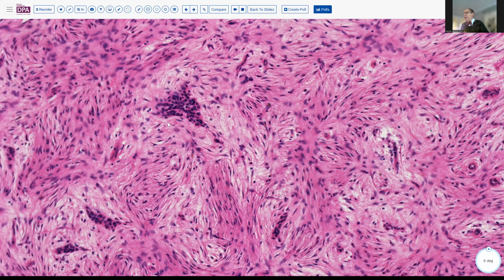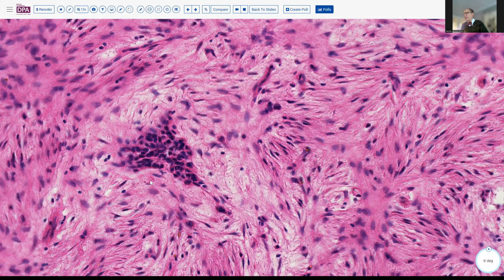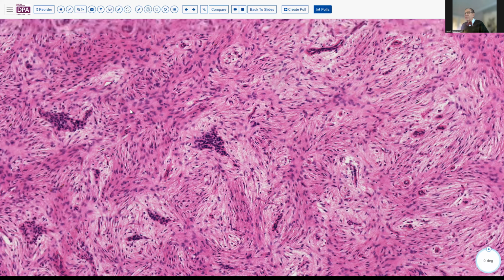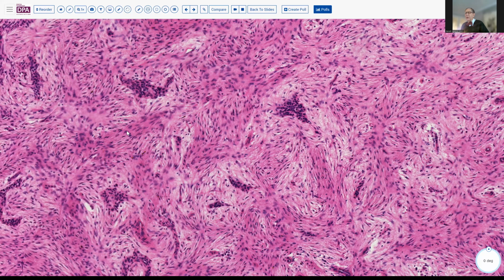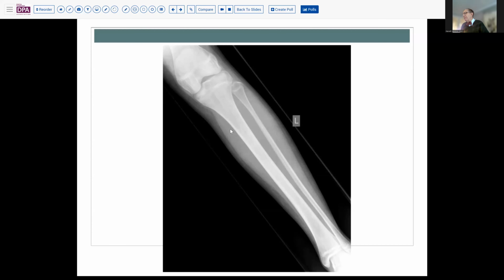So in a 30-year-old, you're not thinking about metastatic carcinoma per se. It does happen, but not usually as frequently as in other things. And so this is a situation where the location is very helpful. And this histology with a sort of biphasic tumor is very consistent with an adamantinoma. As we look at the radiograph of this lesion, here on the AP view, it's barely visible, just a very slight lucency here in the diaphysis, the proximal diaphysis.